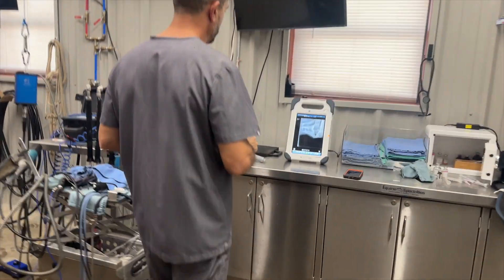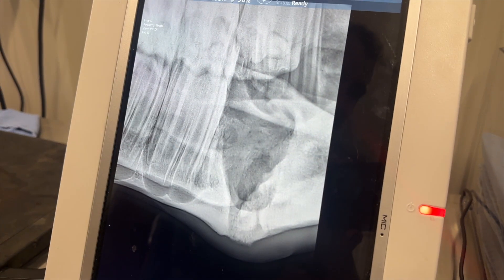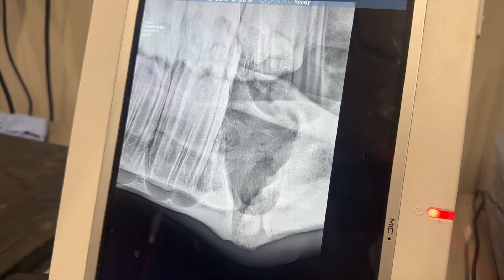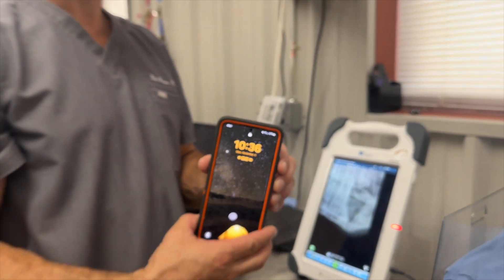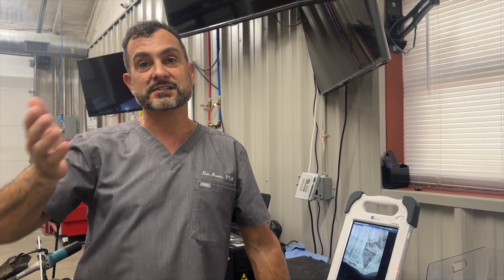Everything went well. We'll show you the post-operative x-ray. We always take a radiograph in these cases to make sure we got all the tooth fragments, because the tooth was broken up. The socket looks good and we've got all the parts out. As for the time — it's 10:36. We started at 9:41, so in less than one hour we did the nerve blocks, the surgery, corrected the shear mouth, took the post-operative radiograph, and packed it — all in about 50 minutes.